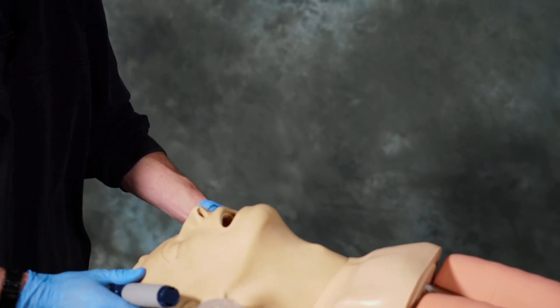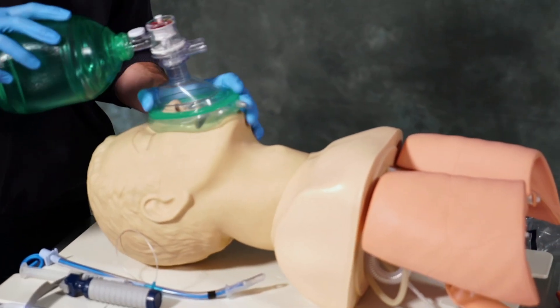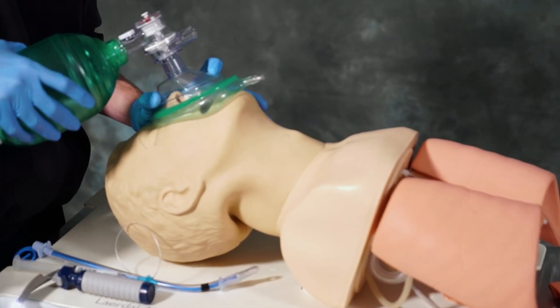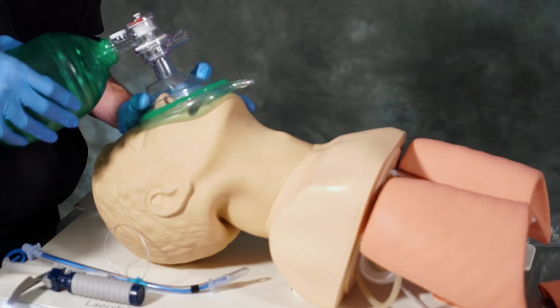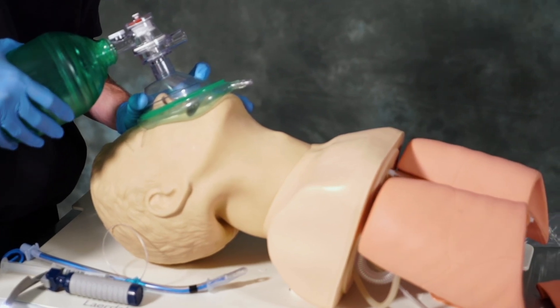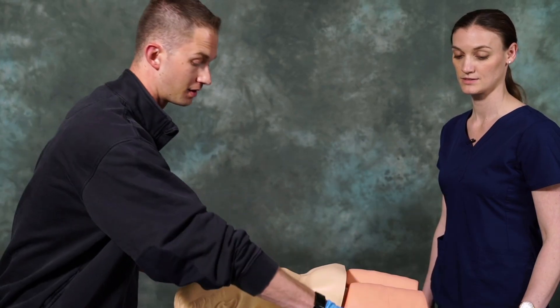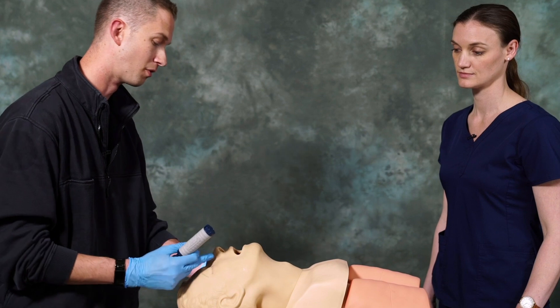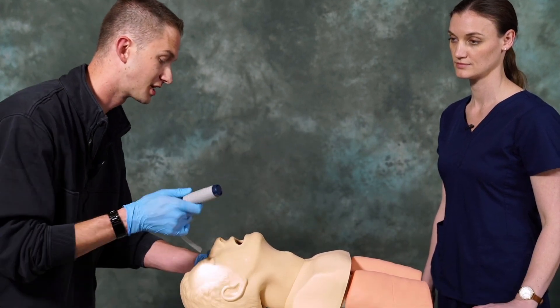To start off, we want to position the head properly and pre-oxygenate the patient. Pre-oxygenating is going to allow more oxygen to get to the patient due to the fact that the patient may be without oxygen for up to 15 to 20 seconds during intubation. Once the patient is pre-oxygenated, we're going to reposition the head into a good sniffing position. We want to make sure that the nose is pointed directly upwards and that we have a good visual of inside the mouth.